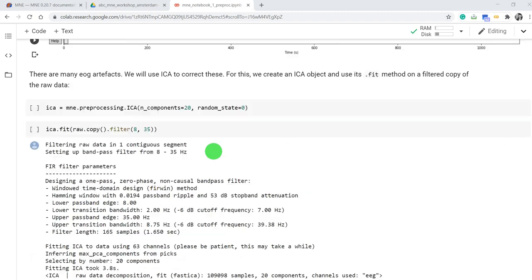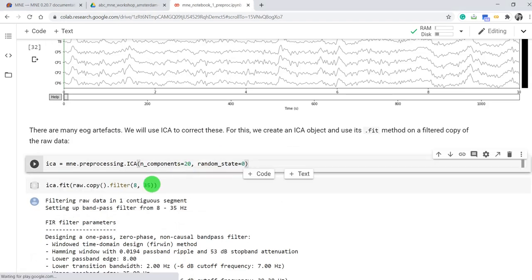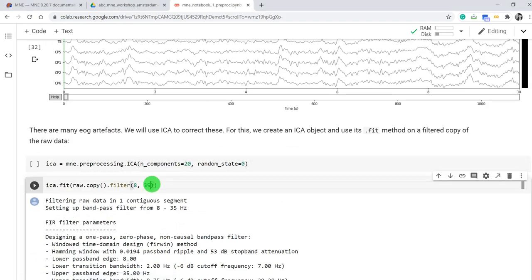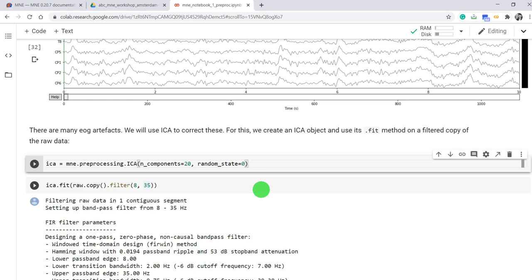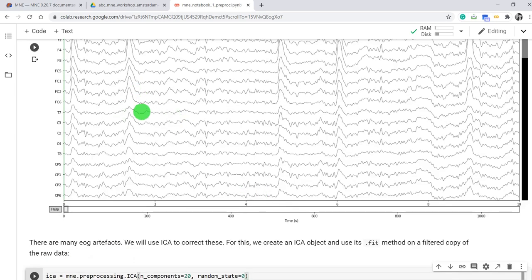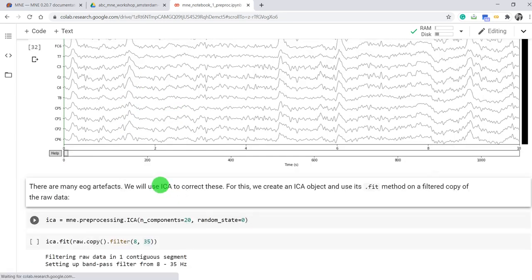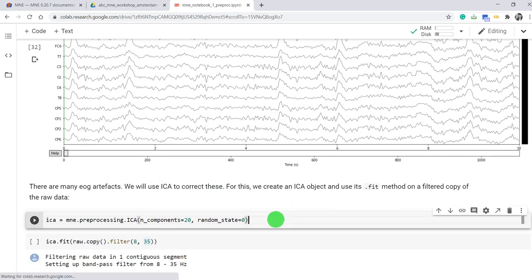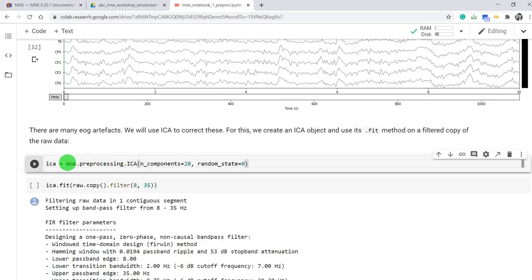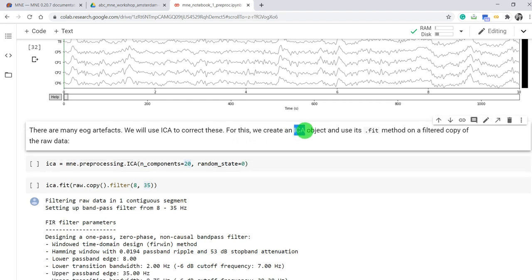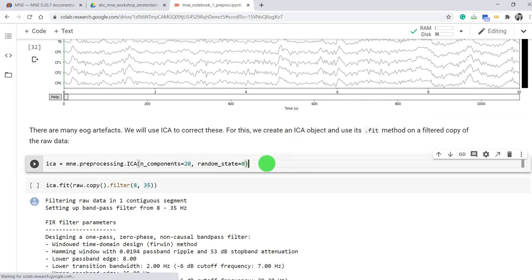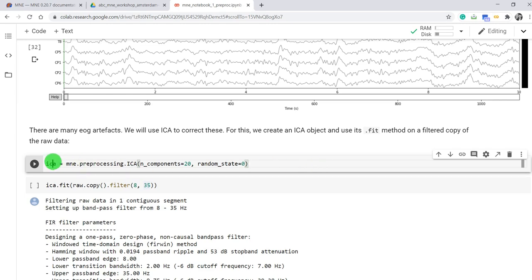So after loading your data, one of the first steps is to pre-process clean those kind of artifacts. The MNE provides different ready-to-use modules for cleaning the data. One of the algorithms for cleaning this kind of eye blink or EOG artifacts is called ICA. ICA stands for Independent Component Analysis. So MNE preprocessing module has different types of preprocessing methods which you can use. Without diving into the theoretical formulation of ICA, let's just see in practice how it works, how it can clean the data.